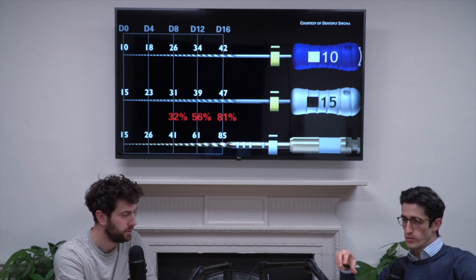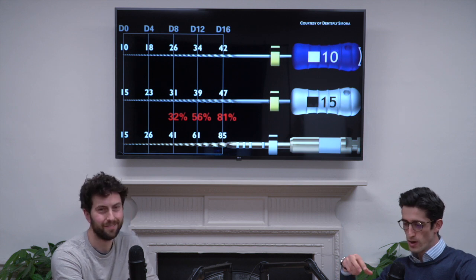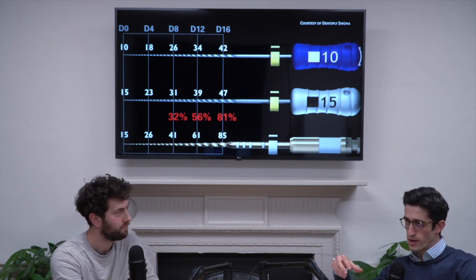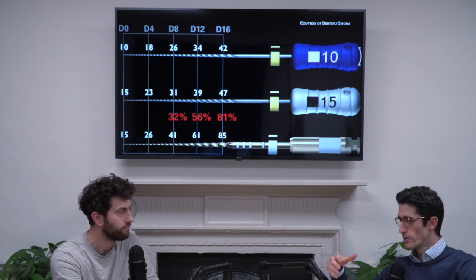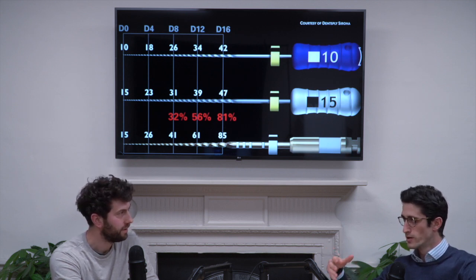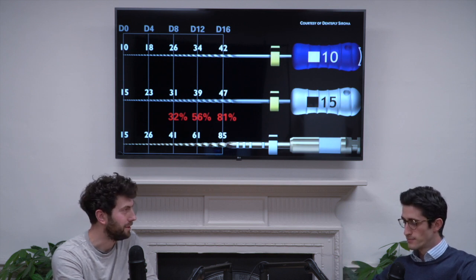Why do we always, you and I probably, unfortunately, know this through experience, get all the issues between the 10 and the 15? That was usually the step where we think, this 15 file doesn't work, or it's weak. Yeah, well, it's just basic mathematics, isn't it?